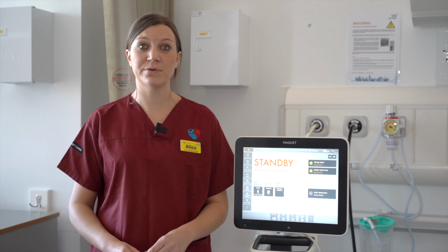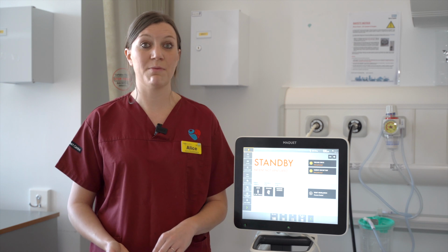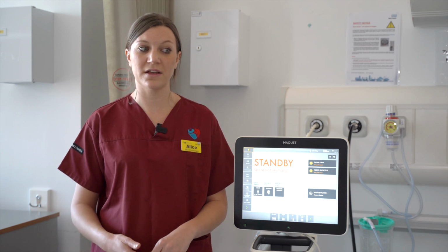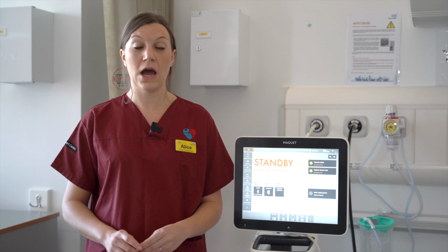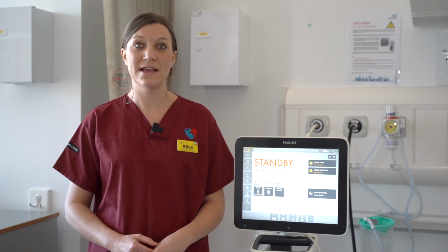It's also really important to auscultate these patients, having a listen for breath sounds, whether they are present or absent or harsh, and also whether there's any additional sounds, any secretion load that can be heard. Remember to check for all patients the length of the endotracheal tube at the lips. That will also be documented on the bedside chart and is checked every shift.